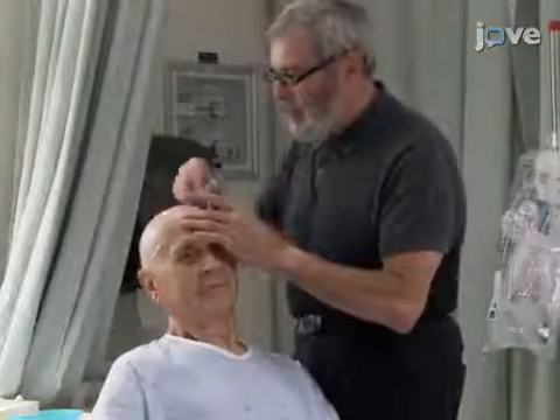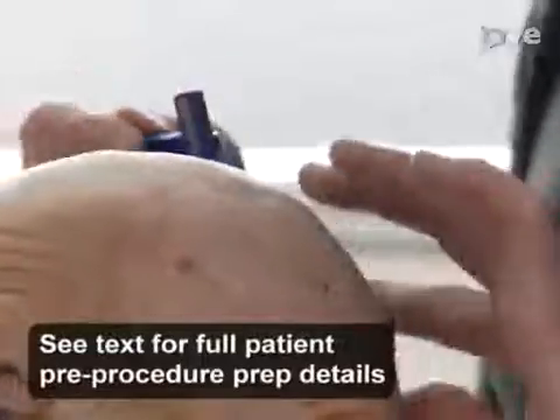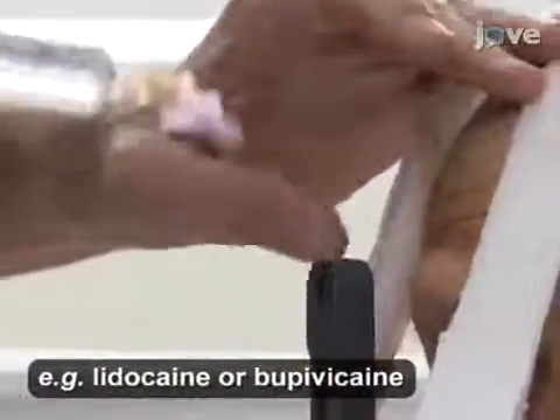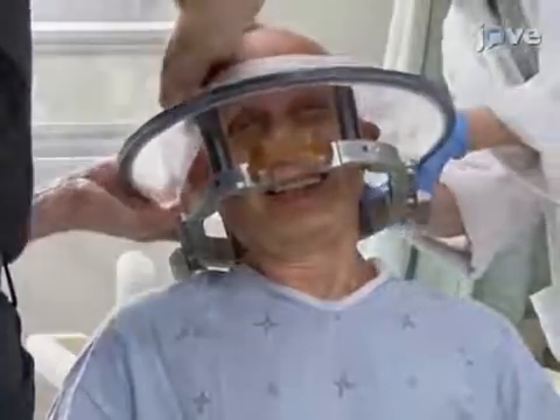Before beginning the procedure, completely shave the head of the patient and check for scalp lesions. Have a neurosurgeon put the stereotactic frame in place and inject local anesthetic at the four pin sites. Place a rubber diaphragm on the patient's head to prevent leakage of the degassed water that circulates between the ultrasound transducers and the scalp, and check the patient for metal pieces.